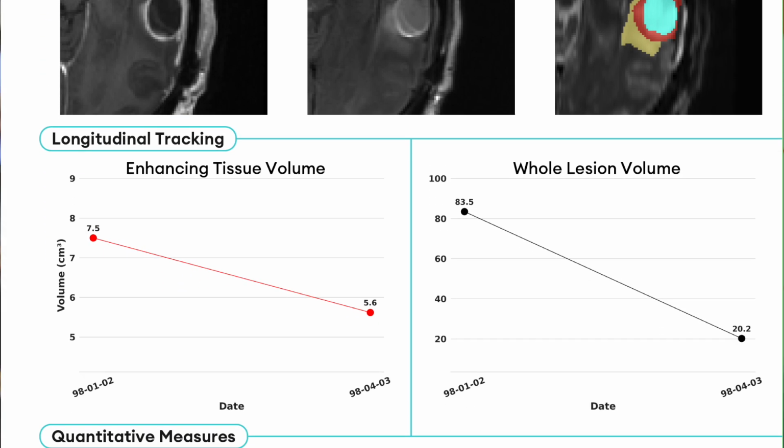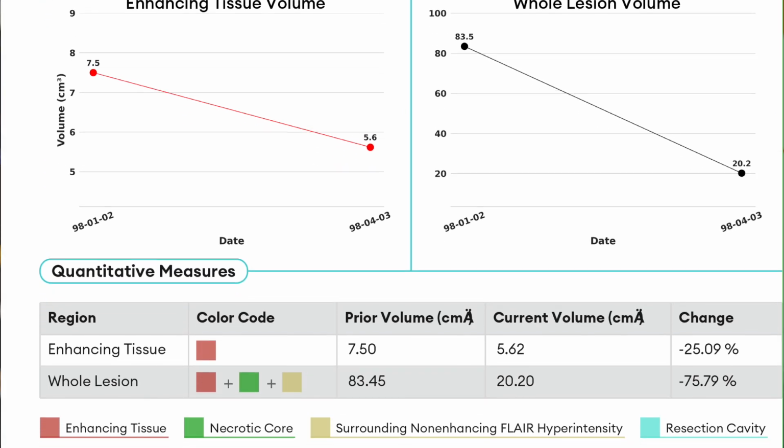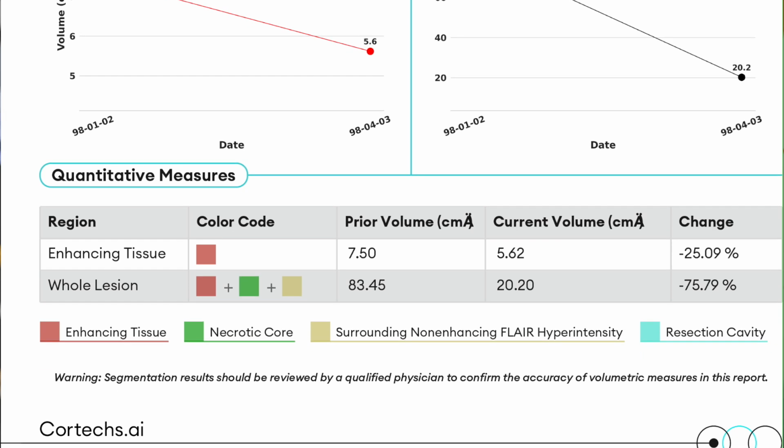It's labor intensive to measure, and the software does a better job at it, at the volumetrics. And truthfully, volumetrics is much better than three plane measurements by us manually. What you might see as just minimal increase volumetrically might actually be a large amount of increase. And so again, very useful tool. I'm guessing you'd agree with that, Dr. Rudie.